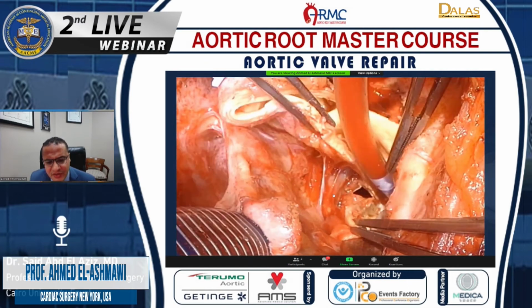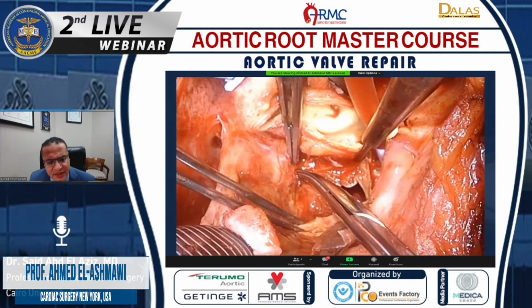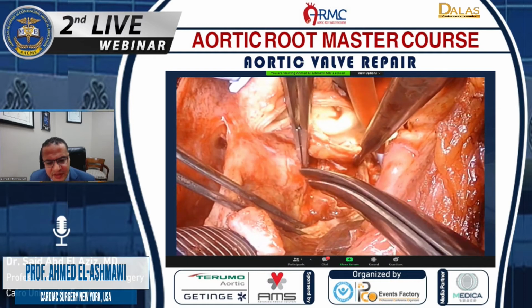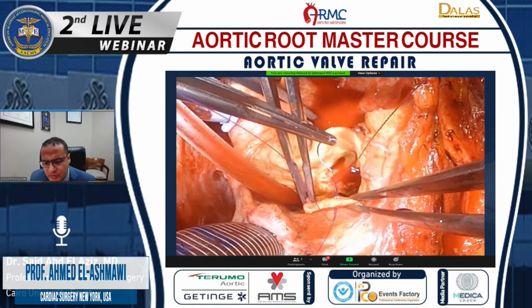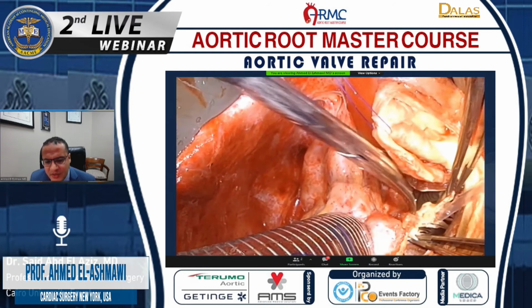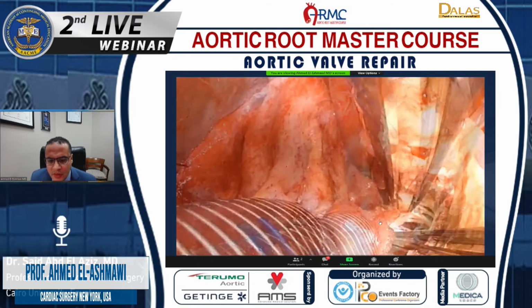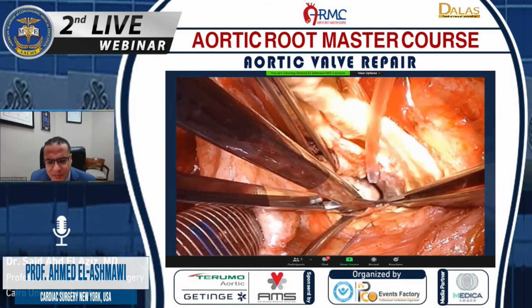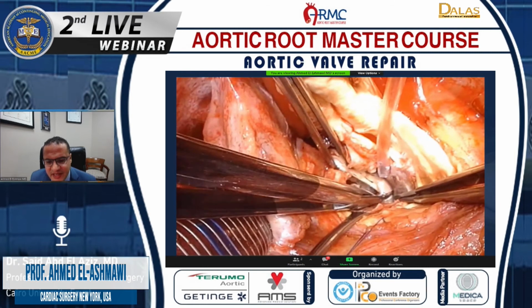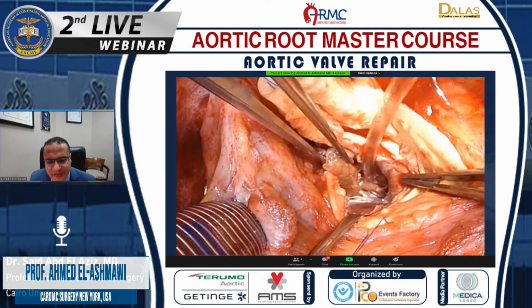We enlarged the left atriotomy toward the right superior vena cava. Some surgeons actually disconnect the SVC, but that's not necessarily needed in all cases. We then expose the anterior mitral leaflet and transect it in the middle of the leaflet, which was heavily calcified. That gives us good access to the subvalvular apparatus. We took out all the hypertrophic papillary muscle, amputating the muscle from the left ventricle because we needed to enlarge the left ventricular cavity.